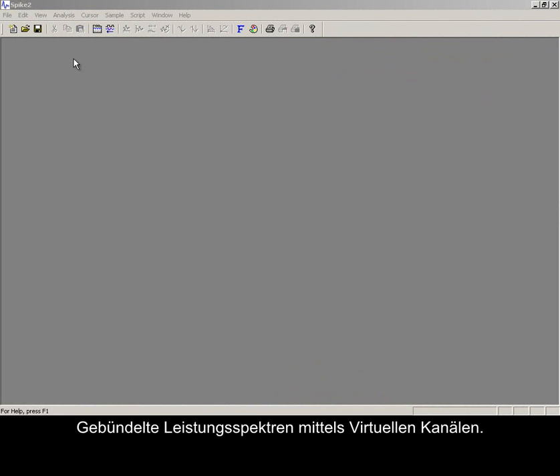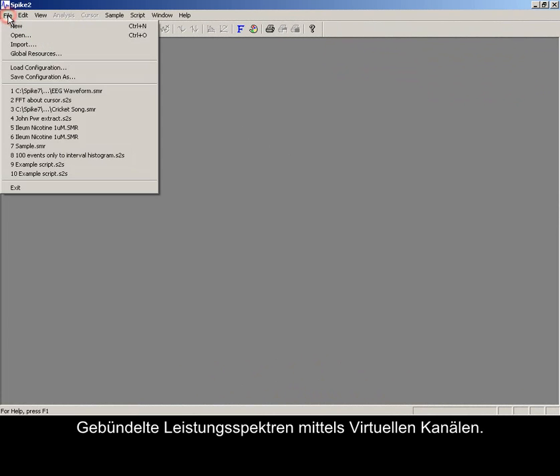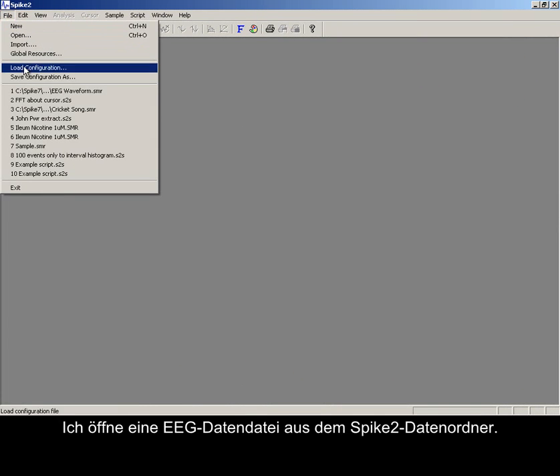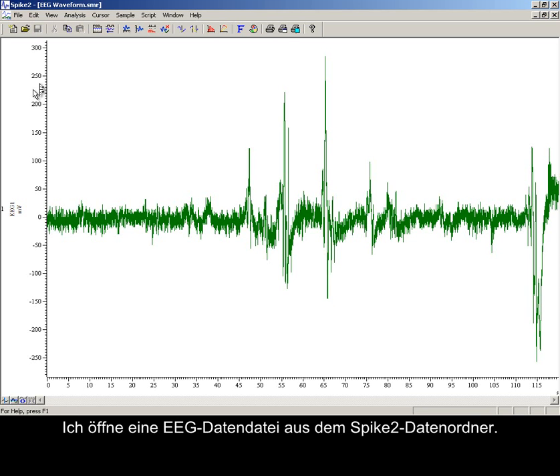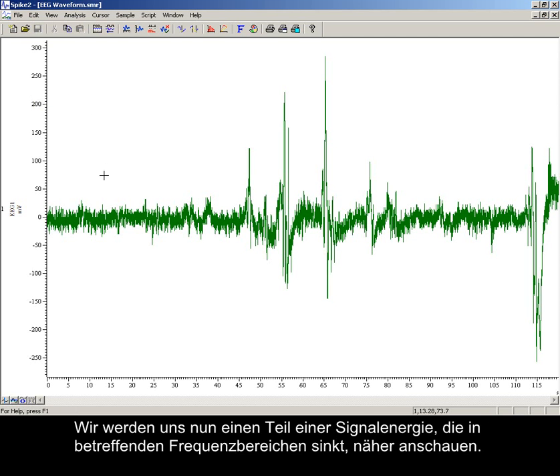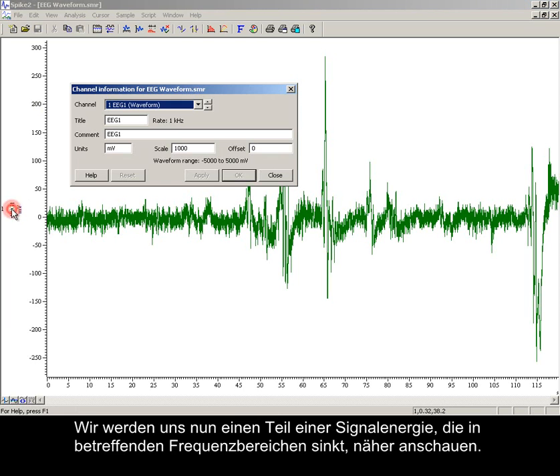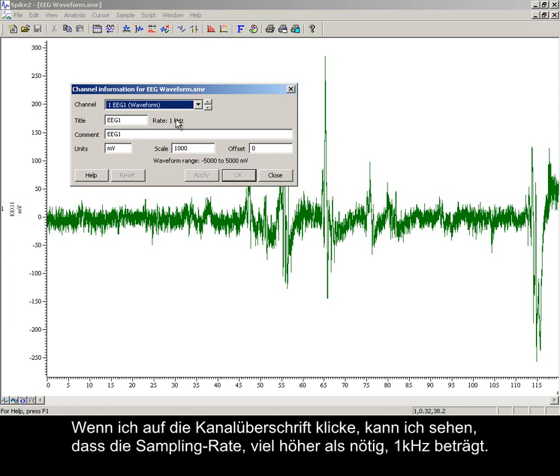Banded power spectra using virtual channels. We will be opening an EEG data file from the Spike2 data folder and looking at the portion of the signal's energy falling within given frequency ranges.